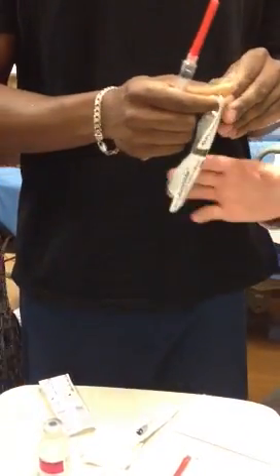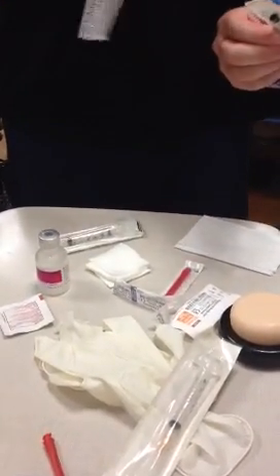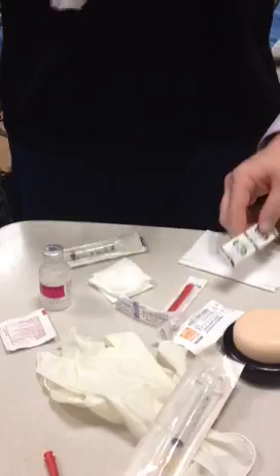Okay. And then where's my needle? It's in here. I'll just use this. What is that? 1.5? 22. Oh, wait a minute. Don't open that up. Well, I guess you can, but then we can't use that syringe. We can use that syringe, I guess. Go ahead, because the other ones aren't safety. I bought a whole box of safety ones. Okay, so I'm going to take that along with the swab, the alcohol pad, a Band-Aid, and the gloves with me to the bedside.